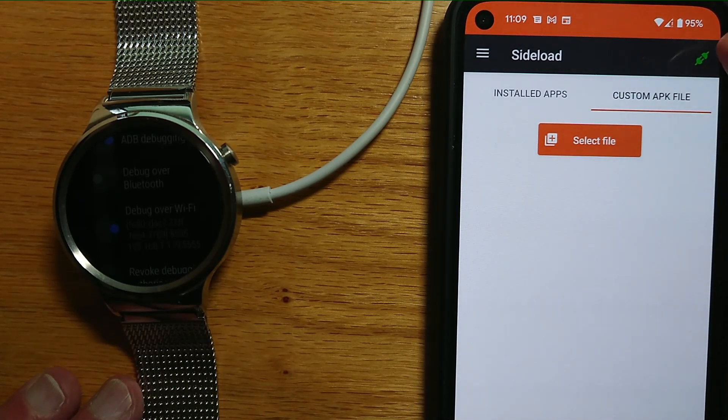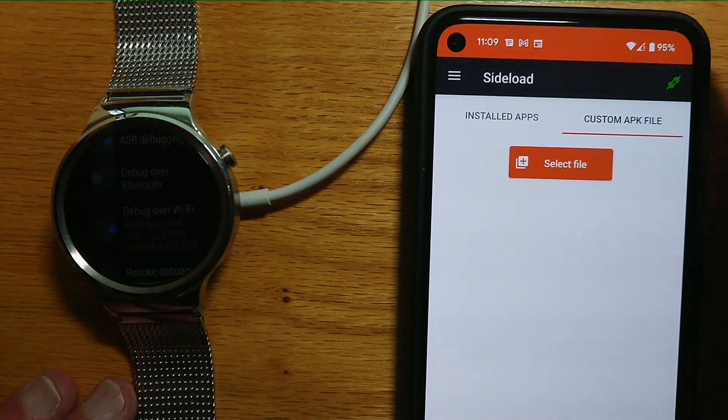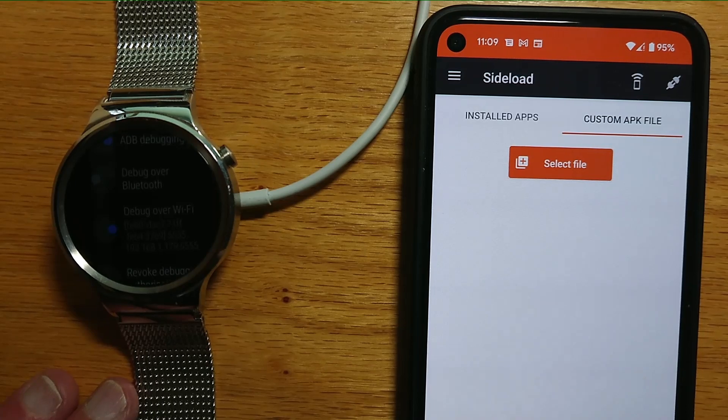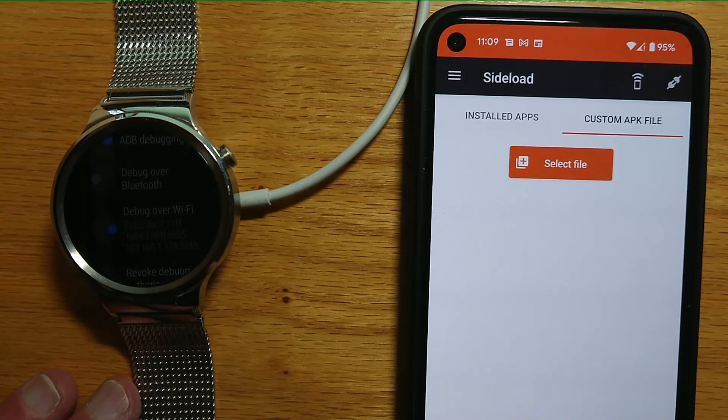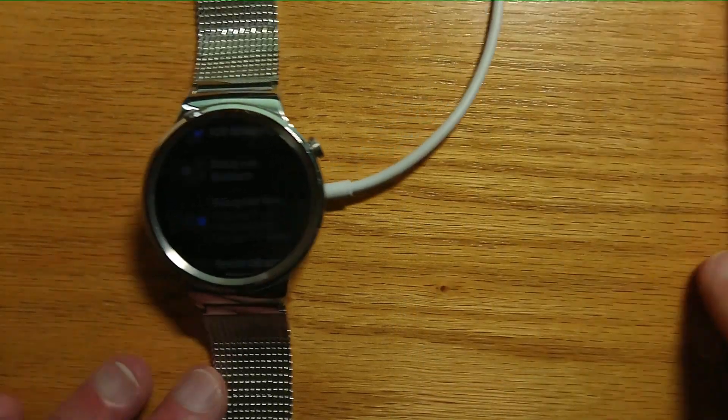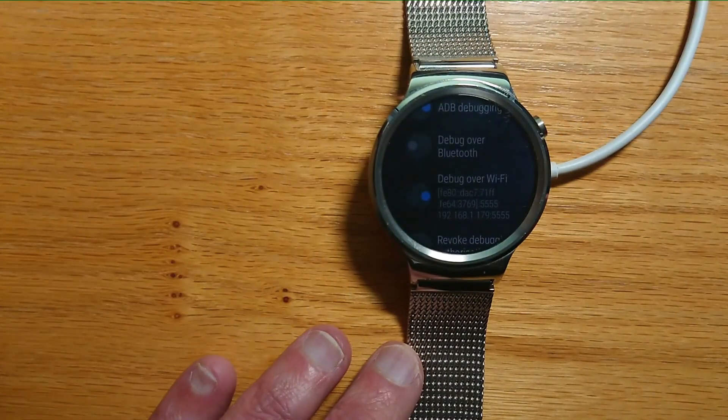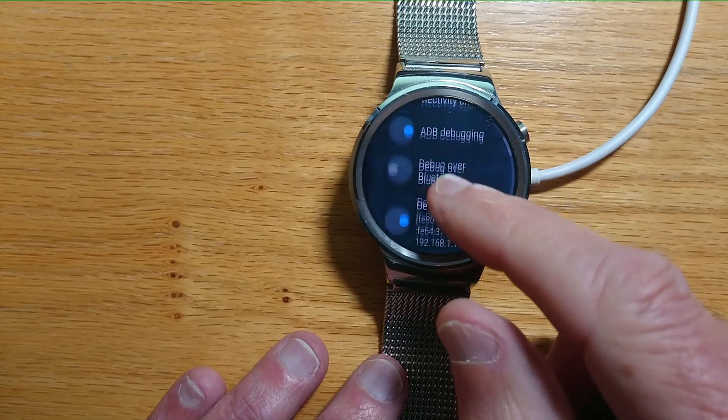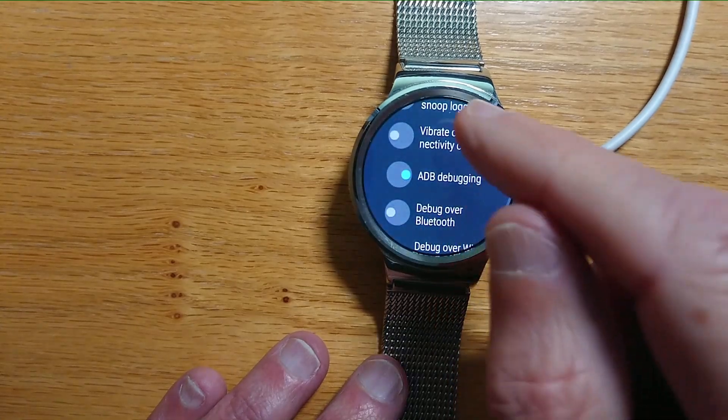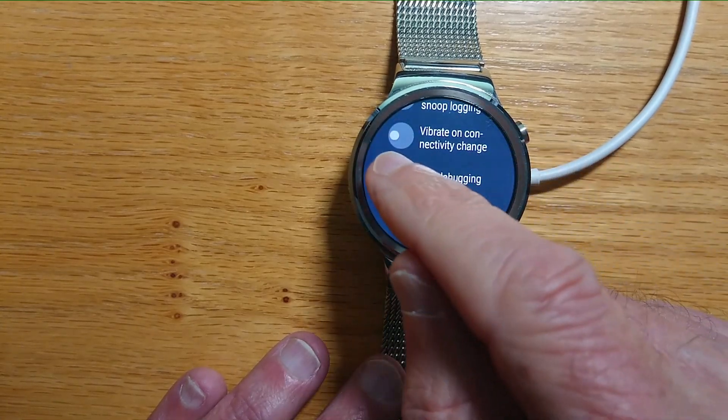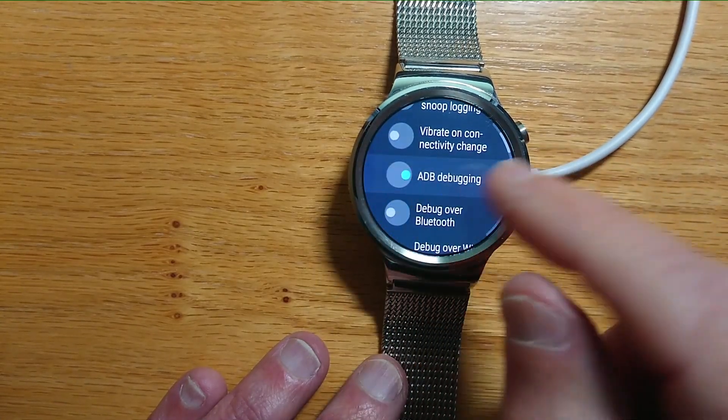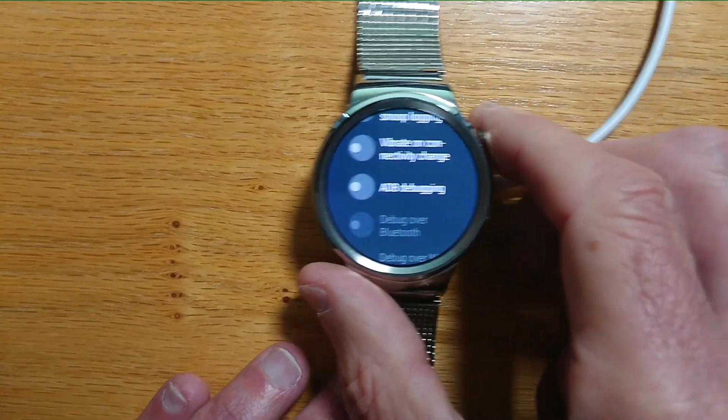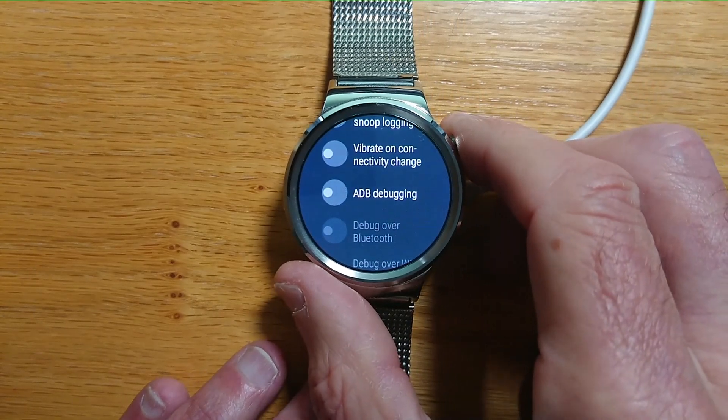So we can now disconnect and turn off ADB debugging on the watch so that we don't use too much battery when we don't need to.